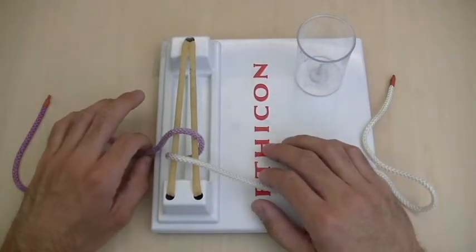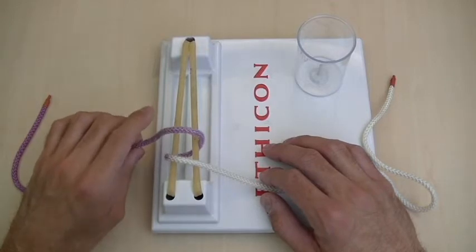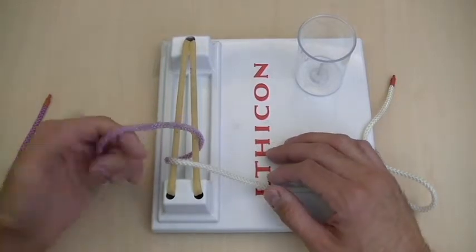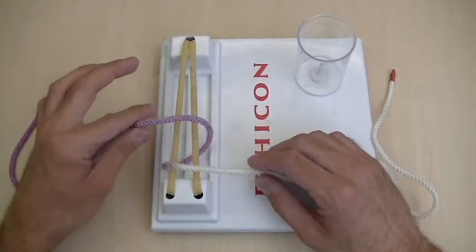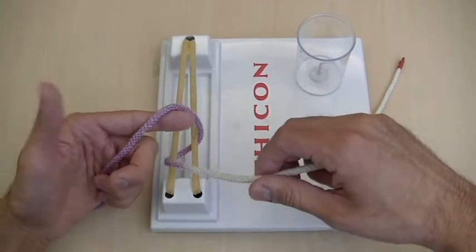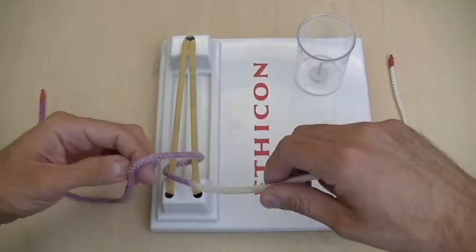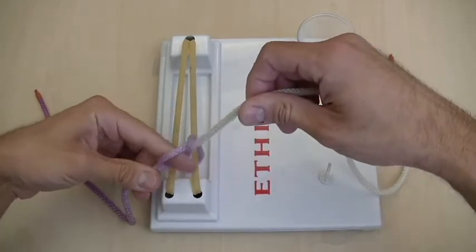Tying a one-handed knot is very easy, as long as you remember that an overhand throw with one hand is similar to doing an index finger throw with two hands. For instance, in this orientation, the purple string is farther away from me, so if I were doing a two-handed knot, I would start with my index finger. Or if I'm doing a one-handed knot, I would do what I call an overhanded throw, which basically looks like this.